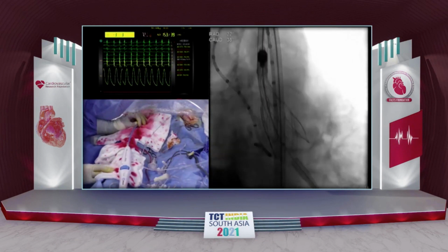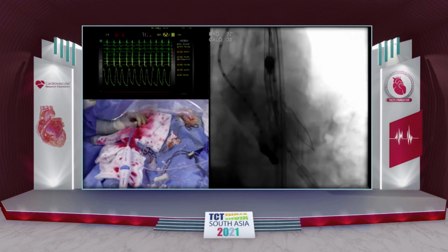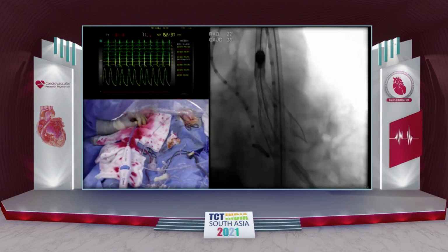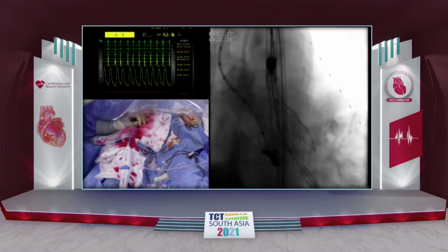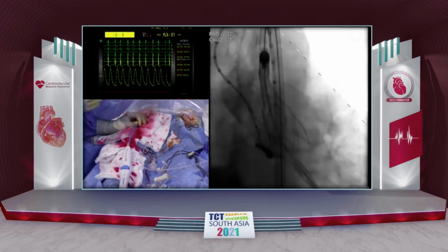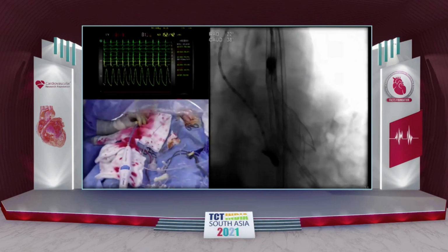You can see the depth in the non-coronary sinus is about 1 to 2, similar to the pure LAO view. And that is what I found by doing this technique: the assessment of depth I get using the frame alignment technique on the LAO, pure LAO, and the RAO caudal is exactly the same.